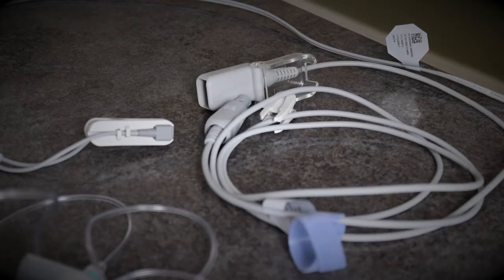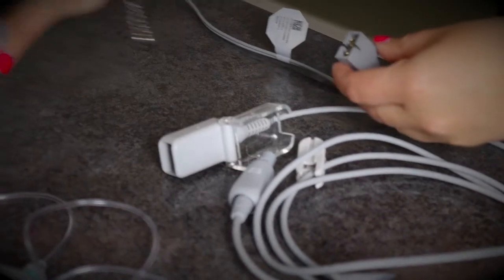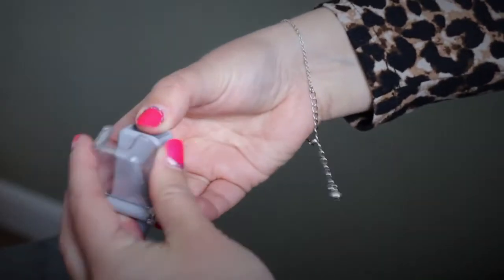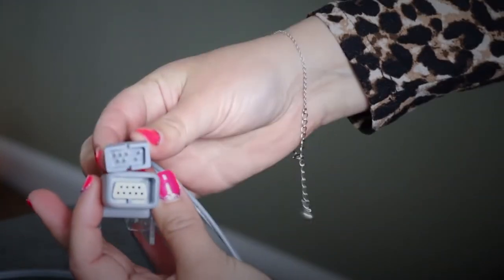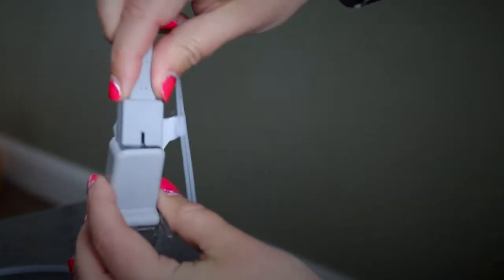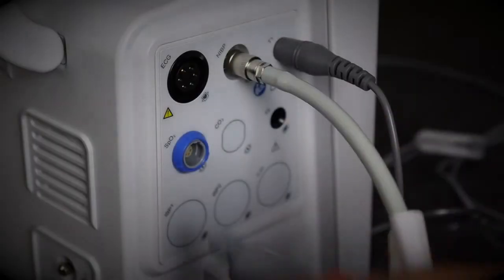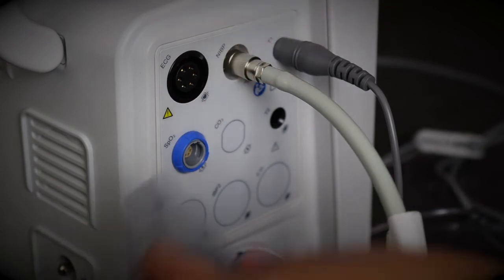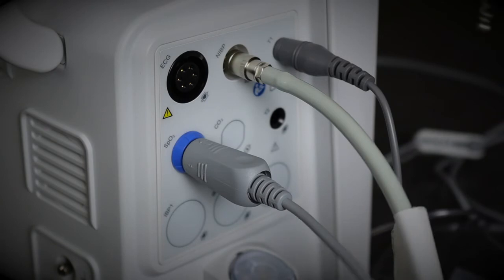For SPO2 setup, this actually comes in two halves: one half attaches to the machine and the other attaches to the patient. Open up the plastic tab, pop it in so the shape corresponds with the inside, and then shut it down. Here is the SPO2 section of the machine — pretty straightforward. You pop it in and it clicks so you know it's secure.